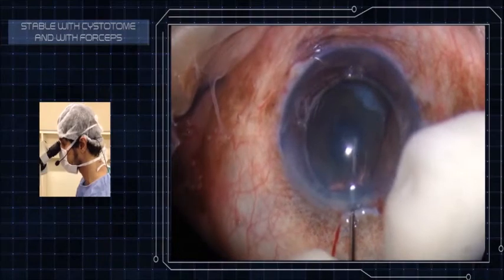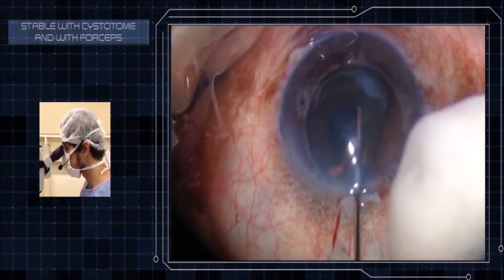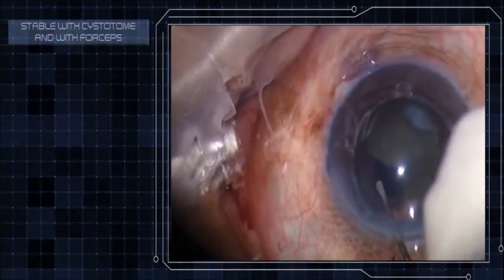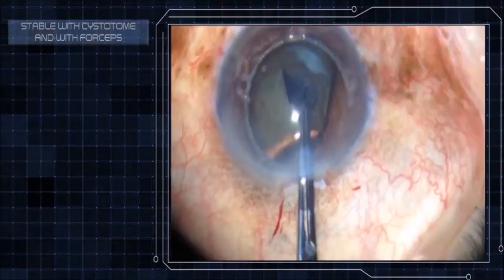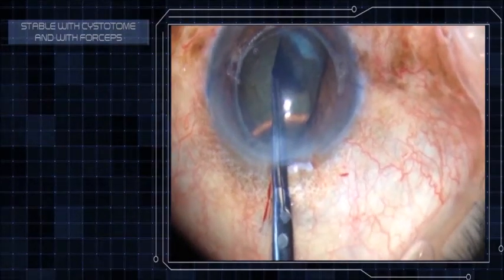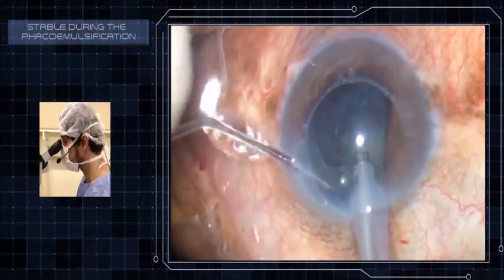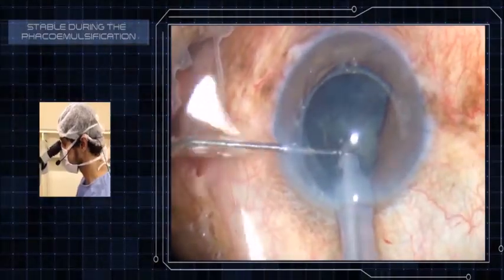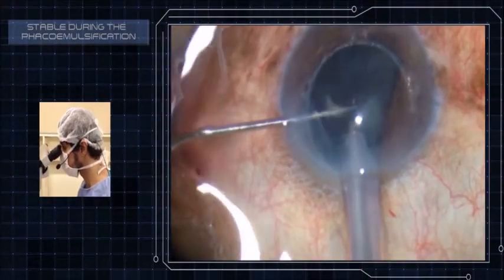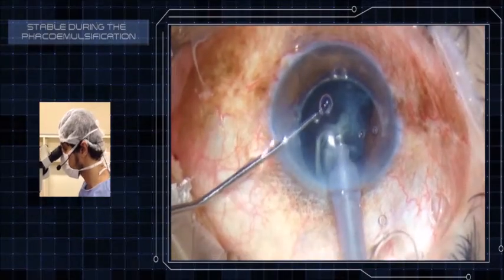Jarvis, I'm starting a new step of the surgery. It's so stable to make a capsulorrhexis. Now let's make a phacoemulsification. The ring didn't touch the capsule bag, and everything occurred normally.